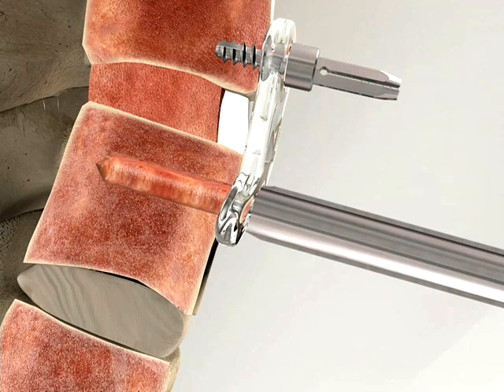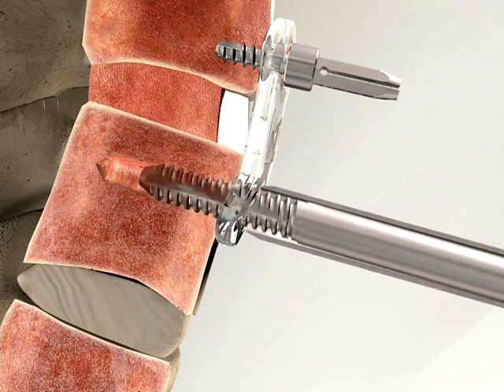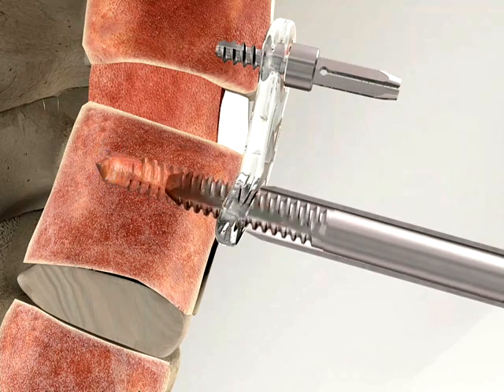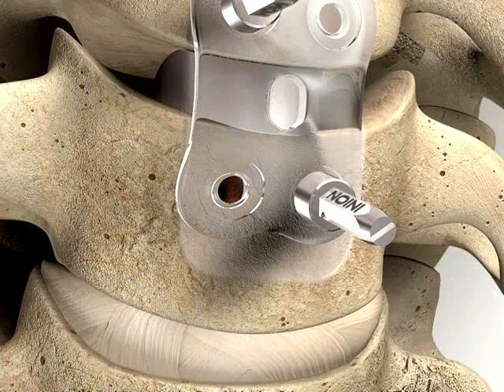Drills and taps are colour coded according to the screw lengths. Manually tap the hole through the drill guide using the correctly sized tap attached to the screwdriver handle. Stop tapping when the tap hits the stop on the drill guide — this will avoid the risk of stripping the thread. The drill guide is used to press the plate firmly against the bone before tapping is started.